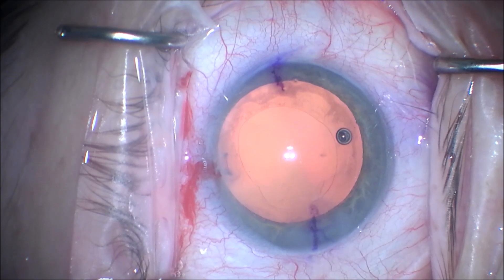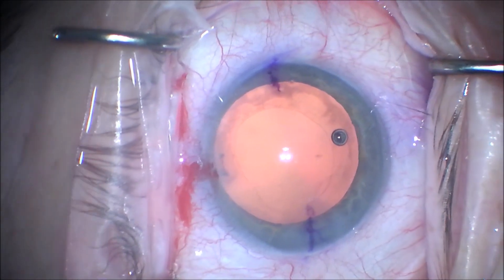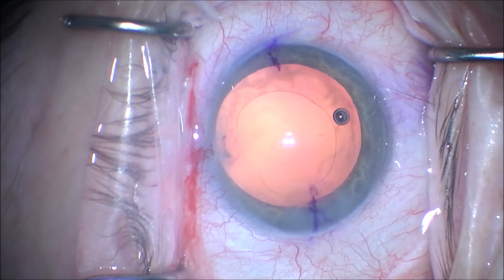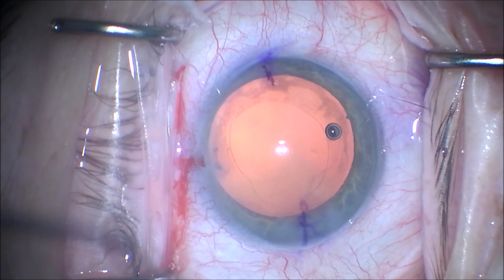The Technus Synergy intraocular lens implant is preloaded in the Johnson & Johnson injector that will go through a 2.4 millimeter incision quite easily. We're putting some anesthetic on the cornea to give the patient some anesthesia.